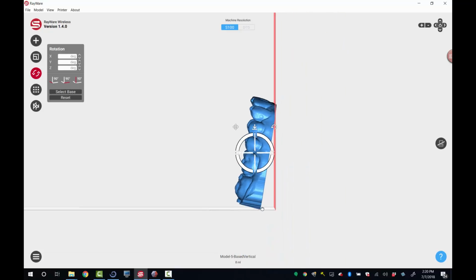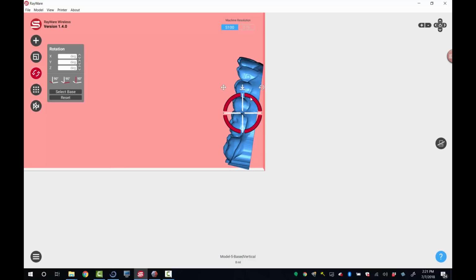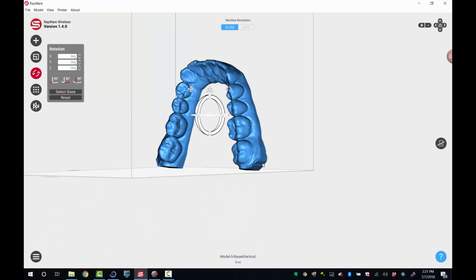I did the exact opposite because I was working quickly, but you want to have it cut slightly like that so the model leans back a touch. Most models can print almost vertical because of the way our teeth are. If our teeth aren't retroclined severely, we're okay.